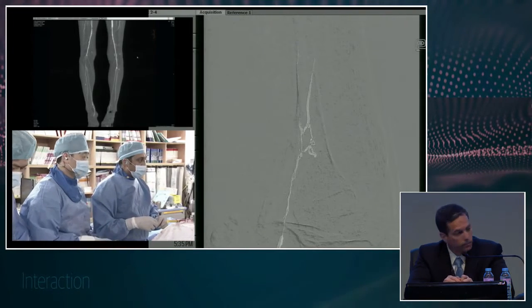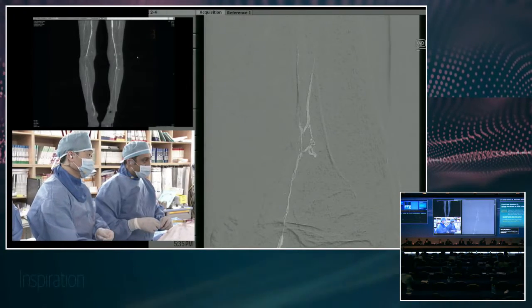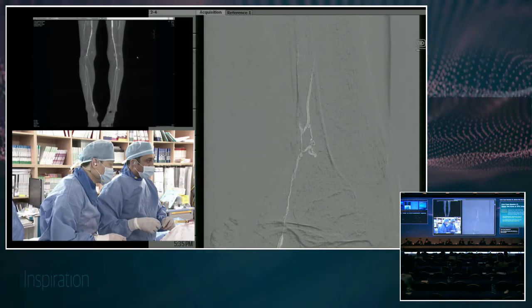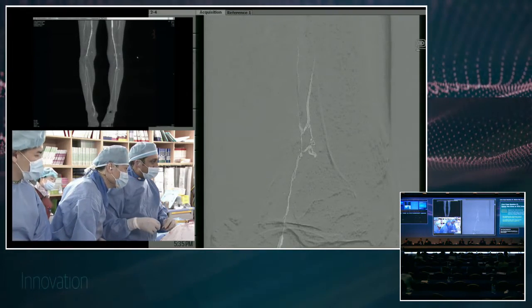Or change the stiff wire at the moment. Right. Yeah. I like that quote, by the way, from Sensei Yokoi, that the same wire goes to the same place. I like that. I think you make a very important point, and you play it out very well here.